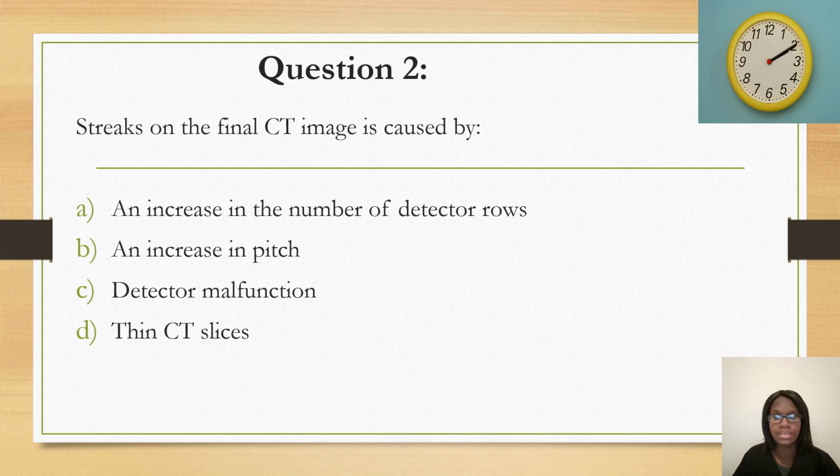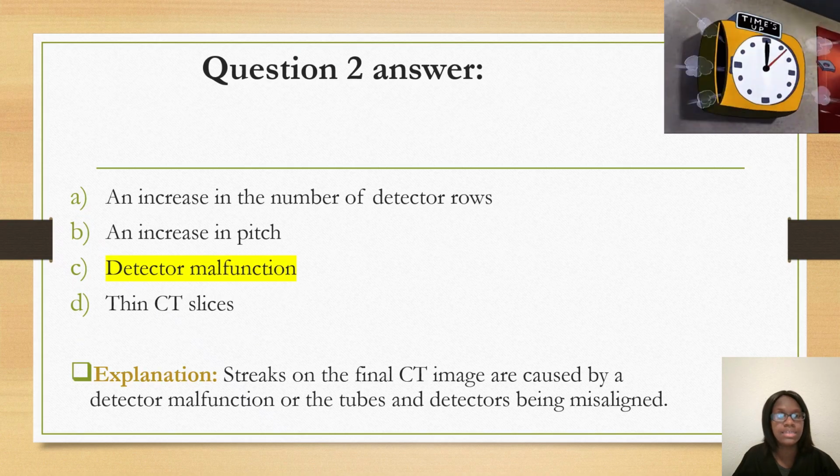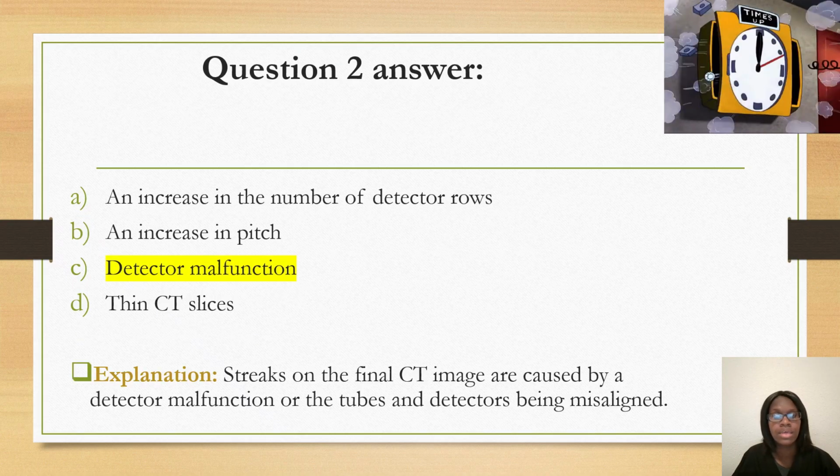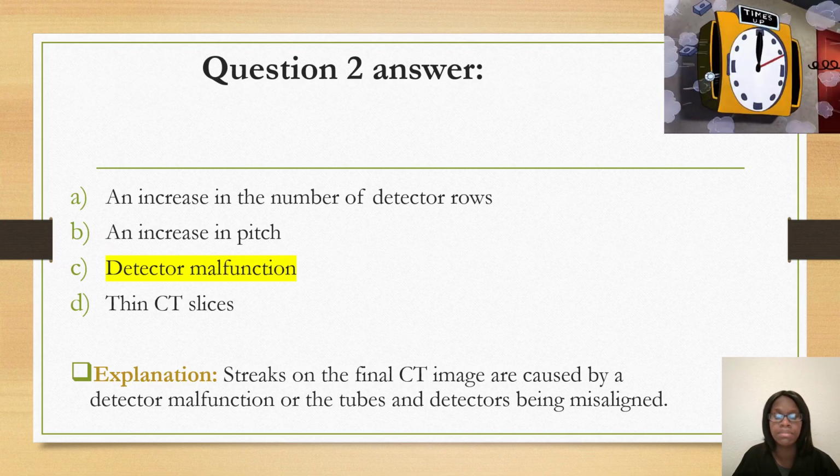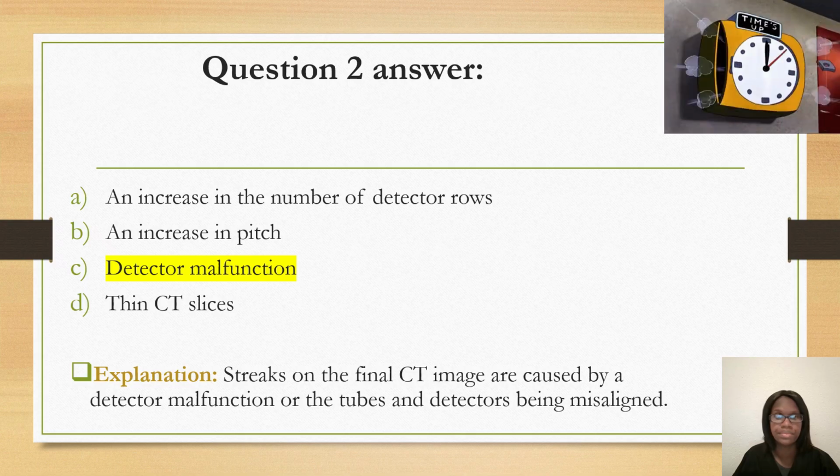All right, the correct answer is C. Detector malfunction. And it is also caused by tubes and detectors being misaligned as well.